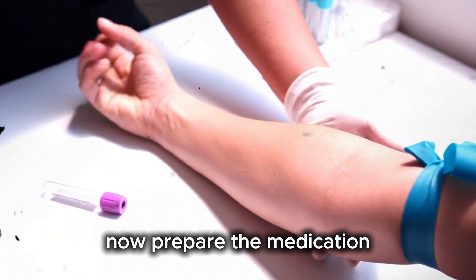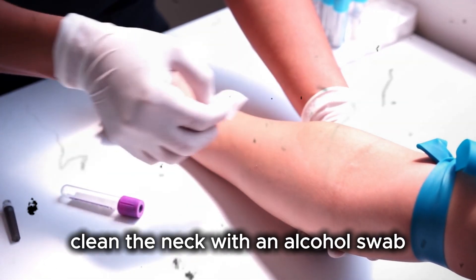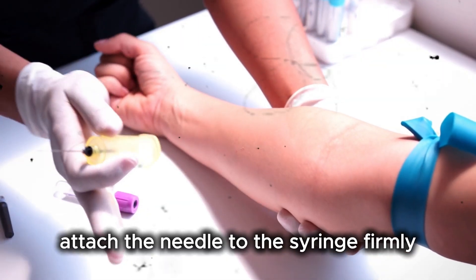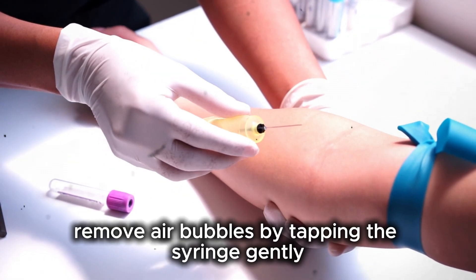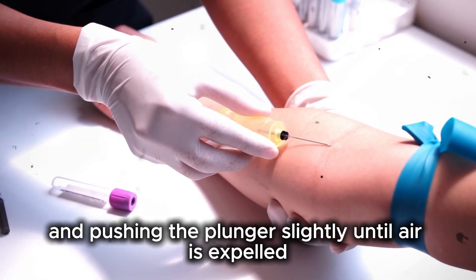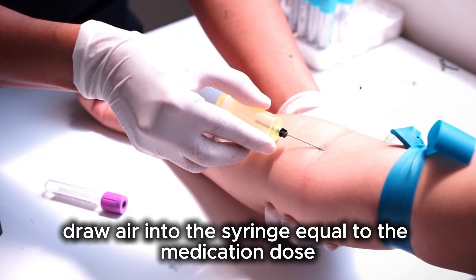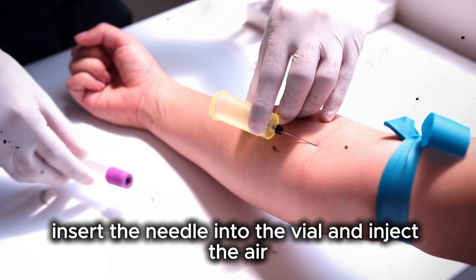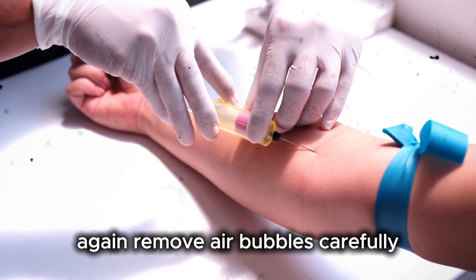Now prepare the medication. If the medicine is in an ampule, gently tap the top to move liquid down. Clean the neck with an alcohol swab. Use an ampule cutter or snap it carefully away from you. Attach the needle to the syringe firmly. Insert the needle into the ampule and draw the prescribed amount of medication. Remove air bubbles by tapping the syringe gently and pushing the plunger slightly until air is expelled.